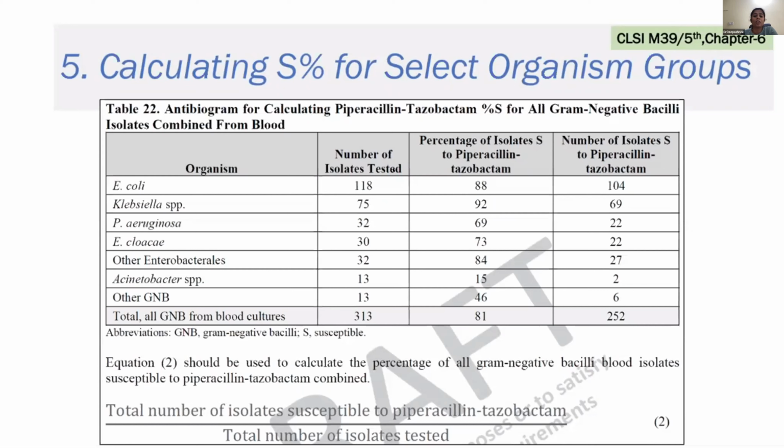This is the formula you use, and you can calculate this for at least the most commonly chosen empirical antimicrobial drugs for gram negative and gram positive, and guide the clinician. Very interesting type of antibiogram, where you are giving an antibiogram even at the gram stain level.